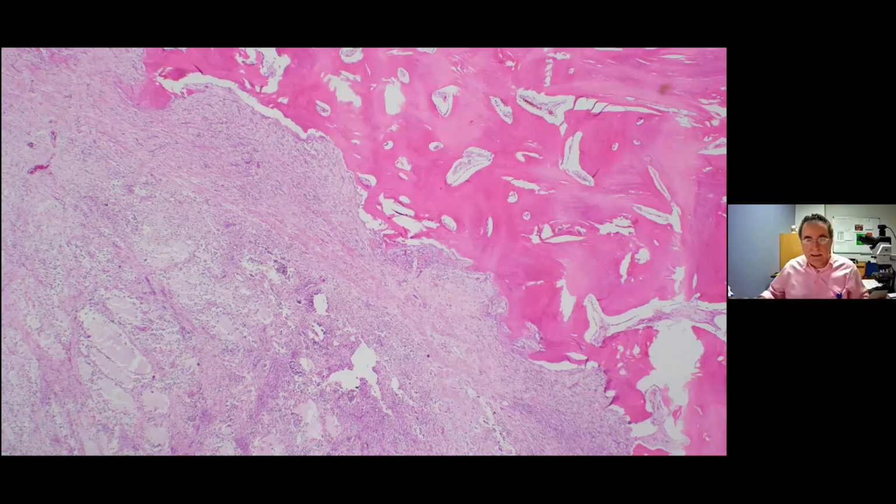Okay, so this is the lesion. And you can see the sharp interface with the adjacent bone. There is minimal infiltration within the bone, but it's not that dramatic. And the lesion appears to be solid with no cystic degeneration. Higher, next slide, please.